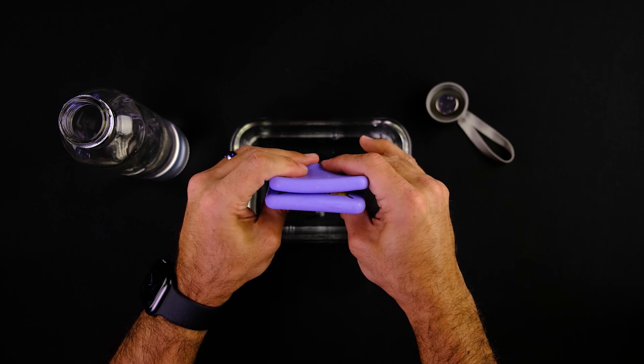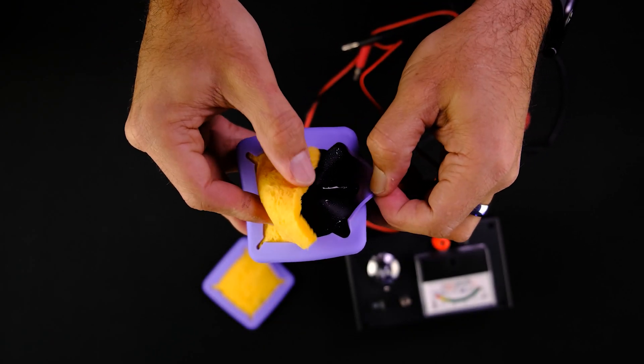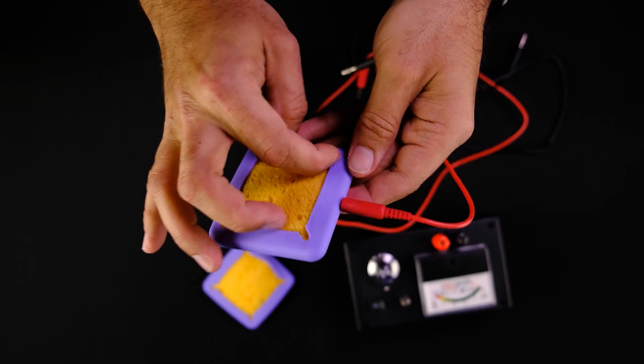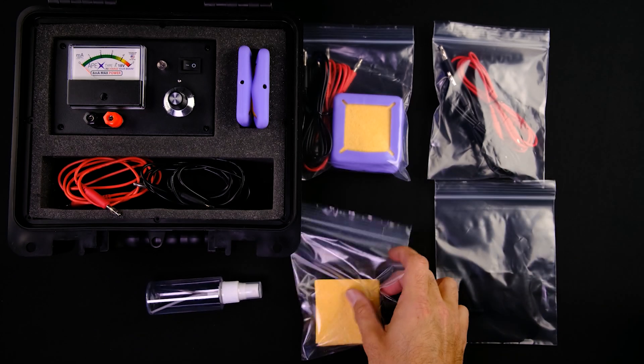You do not need to remove the sponge pads for cleaning. Removing the inner parts increases the chances of the cellulose sponge pads tearing and will cause them to have a shorter lifespan. Keeping your electrosquare electrodes clean by periodic rinsing and storing them in suitable containers ensures that removing the inner parts will not be necessary until you need to replace the sponge pads after about six months. Replacement parts are available on our site at apexdevice.net.